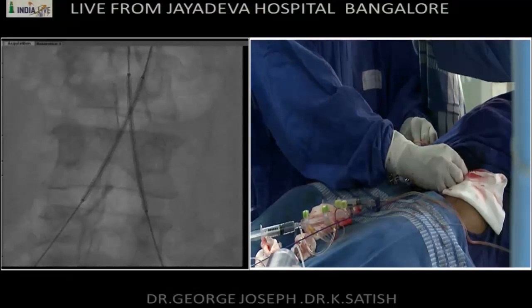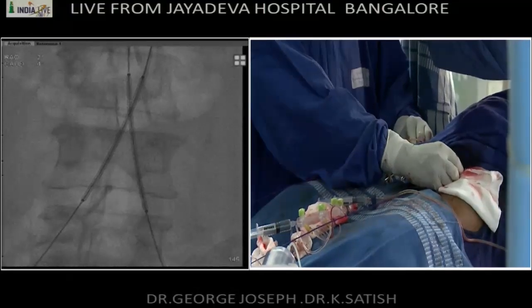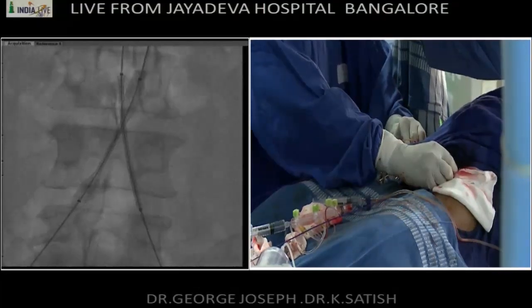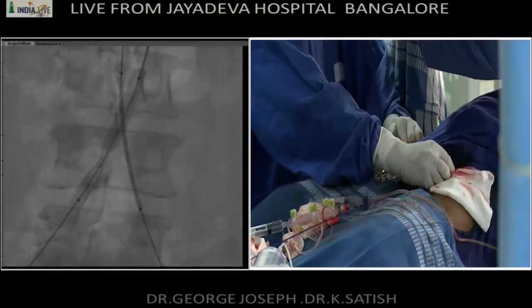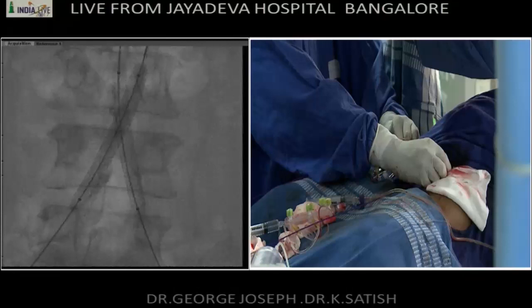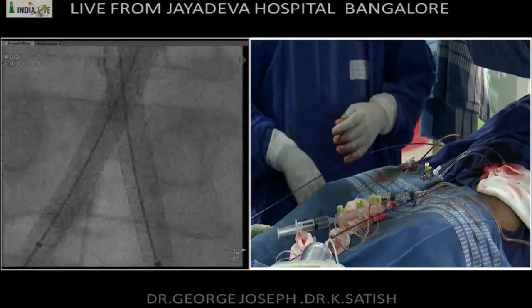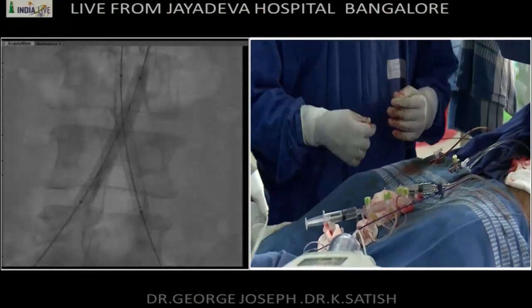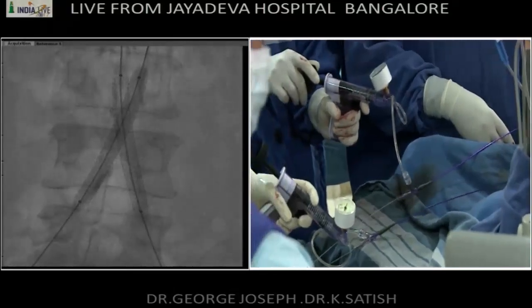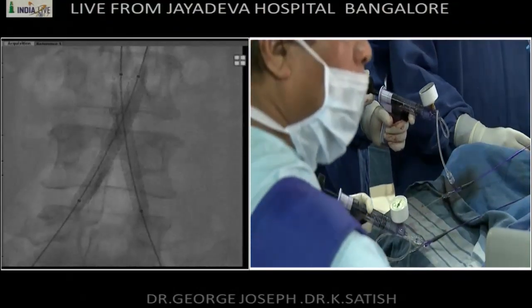Are you both ready? Yeah, both can go, no problem. I'll pull it out. Go, inflate please. Okay, both inflate. One is not inflating. Yeah, 6. Both of you 6. We'll save it. Okay, so I think the stents have expanded at 6 atmospheres, so it should be enough. Maybe you can go to 8, just to make sure, this is the common iliac. He's a big built guy.